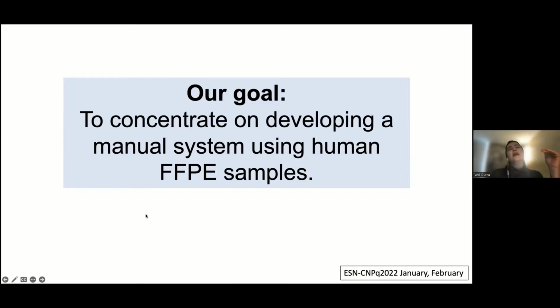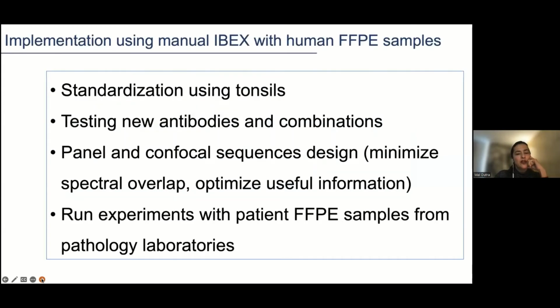So what we did is we took some samples with us from Brazil that were from pathology labs. In the case of Chagas, through a collaboration with Professor Geraldo Brasileiro at the medical school at UFMG. We also had some cancer samples in collaboration with the Hospital Mário Penna in Belo Horizonte, and also some leishmania samples from the University Hospital in Bahia. So we took the samples and we went to Andrea's lab to try to establish this methodology there.